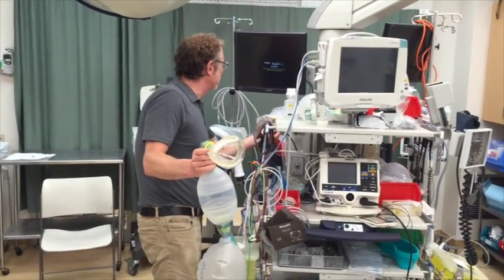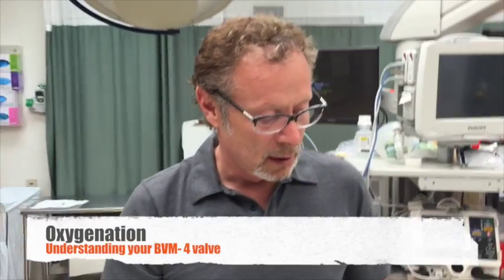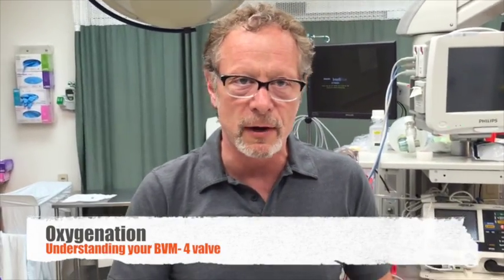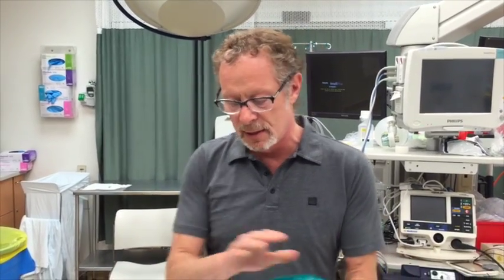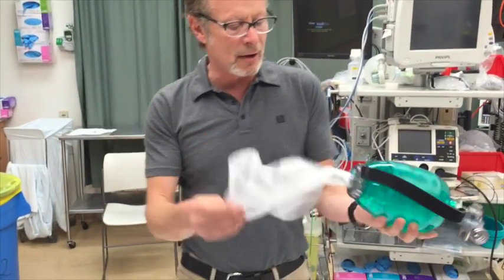Now I'm going to show you a very different system. This is a very different device from the Lairdell BVM — they look the same, different colors, but it is a different device. Let's go over how they differ.